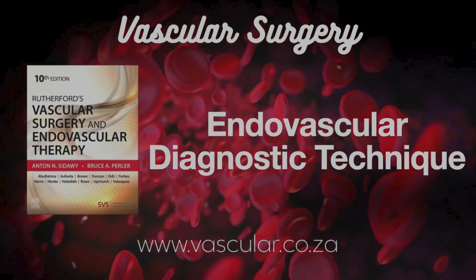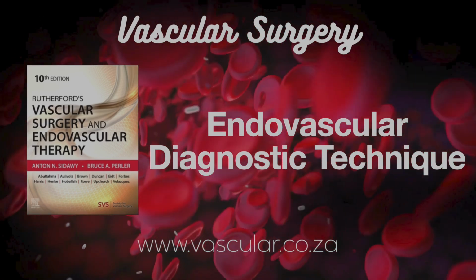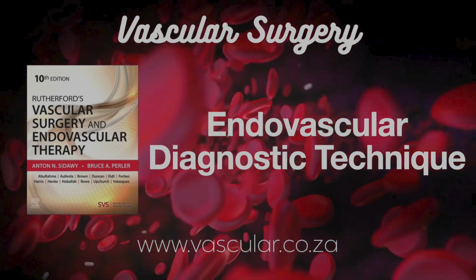Does guidance help prevent these? Yes, using fluoroscopy and especially ultrasound during access has significantly reduced these risks. But patients who are obese, have bad atherosclerosis, or are on blood thinners are still at higher risk.